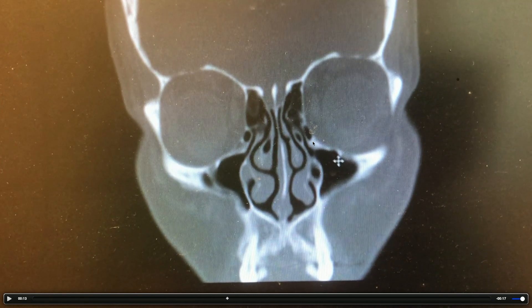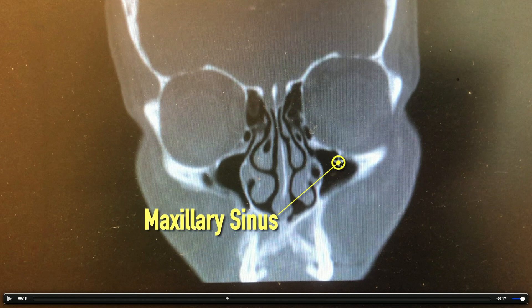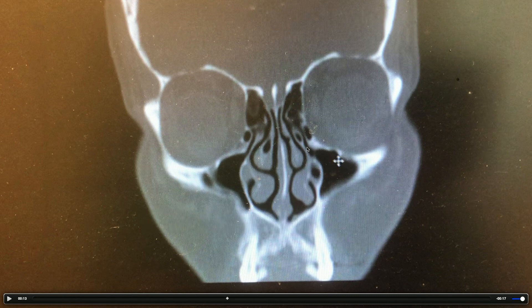As we go further back in those coronal cuts, now we're going to see the maxillary sinuses. Here's a star right here — that's just underneath the left eye socket. And right here is where that sinus drains. On the right side, again, normal sinuses. Black means air. You're seeing black sinus, which means air, going and draining out of that infundibulum right there.